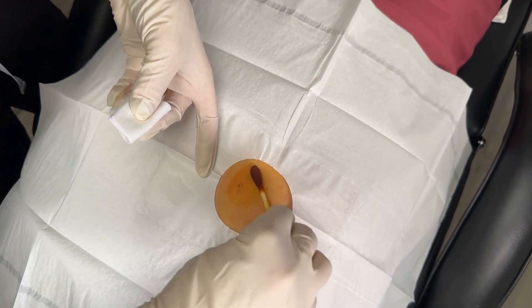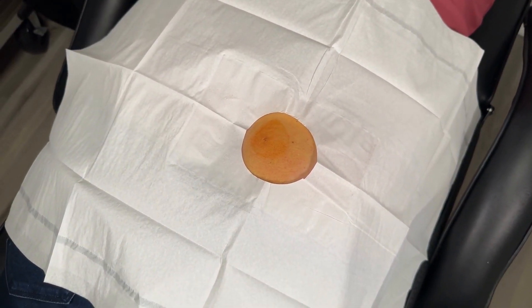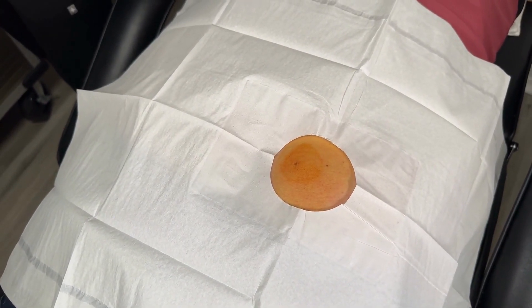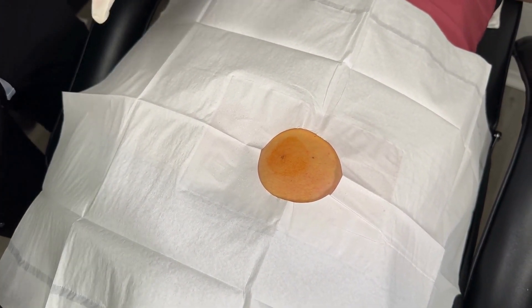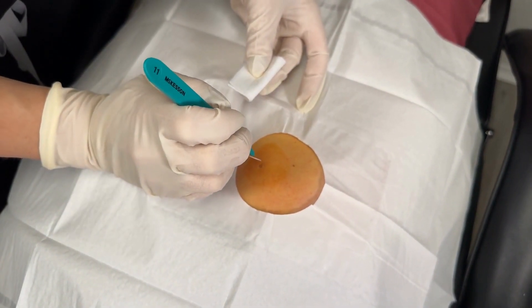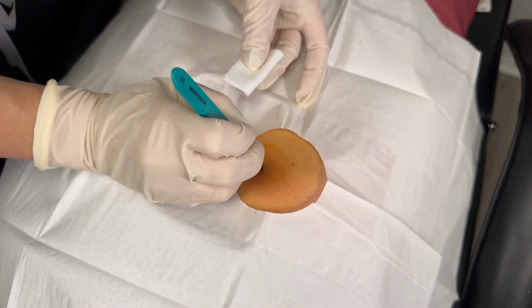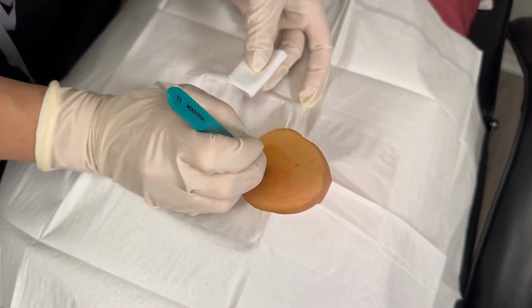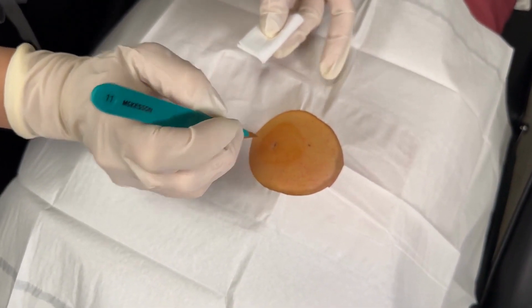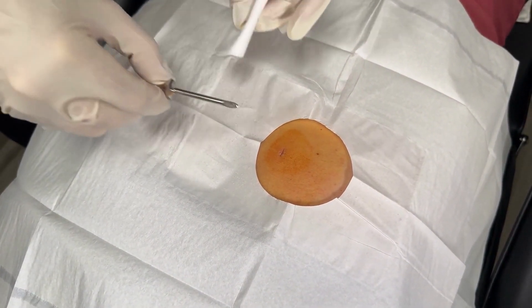When we do the pellets, each time we use the same incision just on a different side. So if you start with your right side, the second time you get pelleted we'll go to the left side. You can usually see the little incision — that's where we will do your first one. It's a tiny little incision about the size of a fingernail. Women typically get just one track of pellets; men will get a lot more.